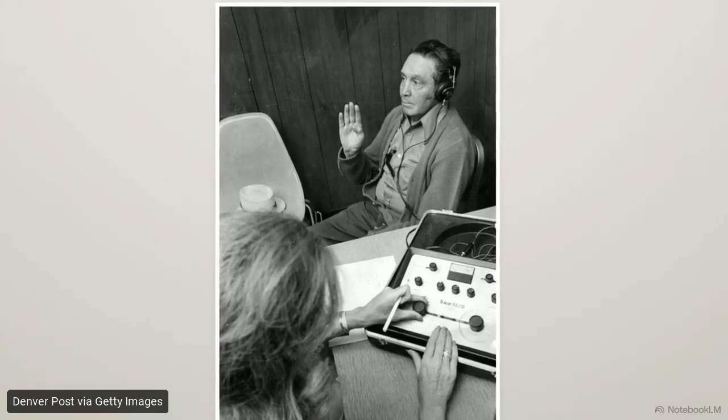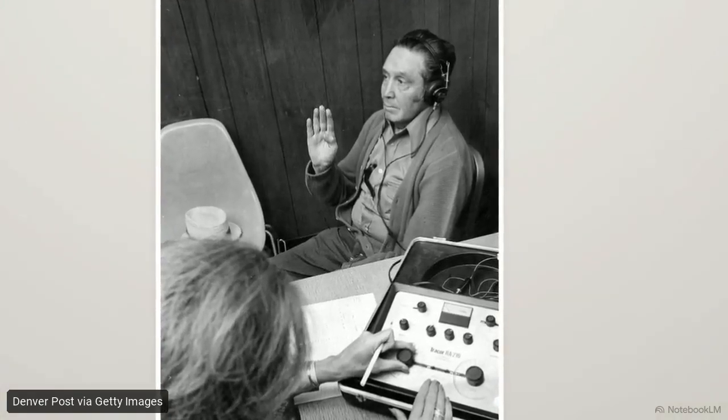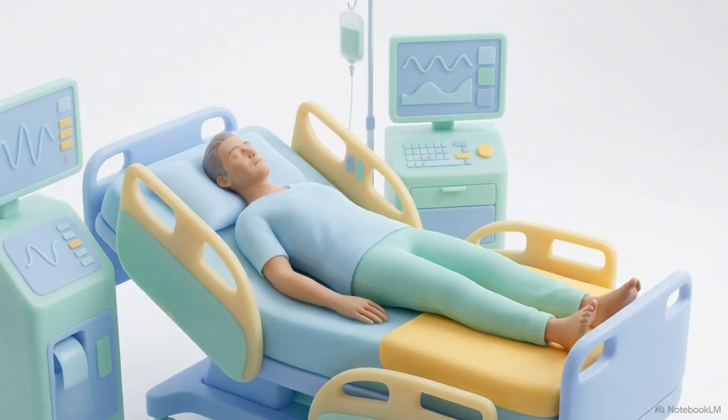A standard hearing test operates on a simple behavioral feedback loop. The clinician plays a tone, and the patient raises a hand. It requires a conscious, cooperative subject to confirm that sound has been registered. But this methodology hits a strict clinical limit when that feedback loop is broken. If the patient is a sleeping infant, comatose, or otherwise unable to respond, traditional behavioral audiometry produces no actionable data.